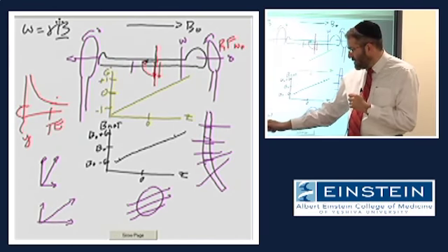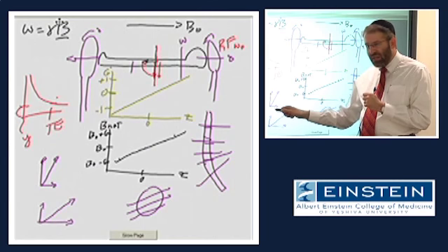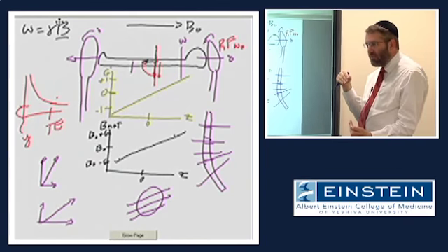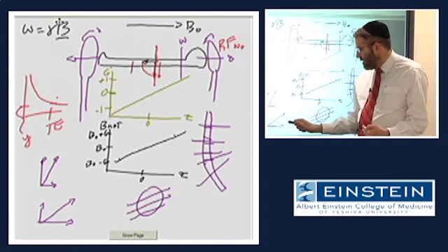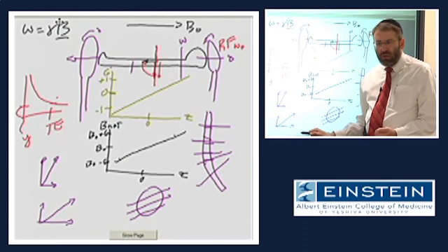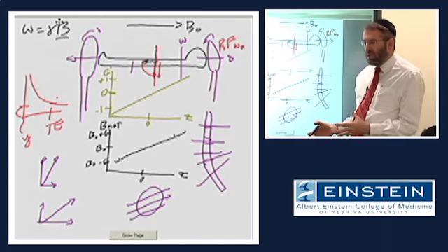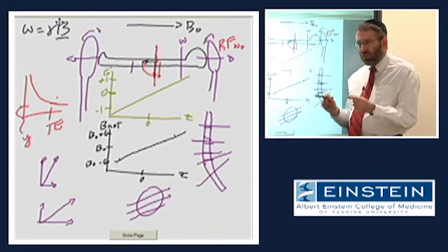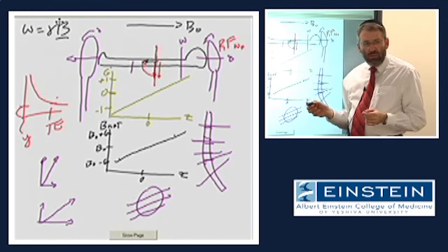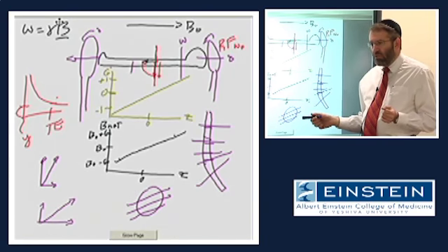Because, as we just discussed, the orientation of that oblique depends on the difference in magnitude of the component magnetic fields. And generating certain very steep oblique gradient magnetic fields may demand that you put a tremendous, perhaps unacceptable amount of power into one of those gradient magnetic fields. So depending on the scanner and the quality and performance of the gradients you have, you may run into a situation where you try to set up some complex oblique image and it tells you you can't do that. The likely reason is this limitation on gradient power.